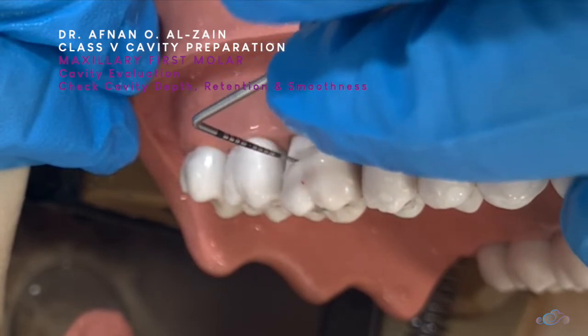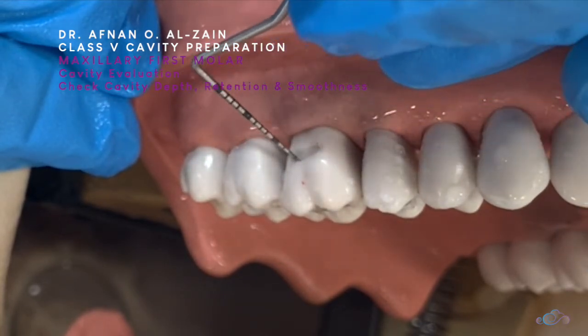The depth of the cavity is equal, and the floor is smooth — there are no ledges or anything.